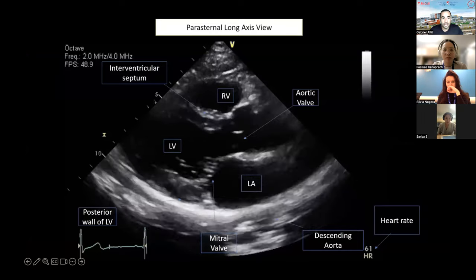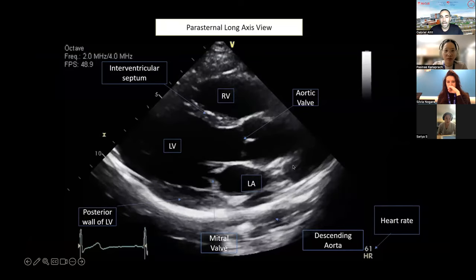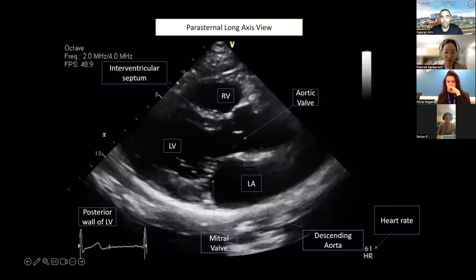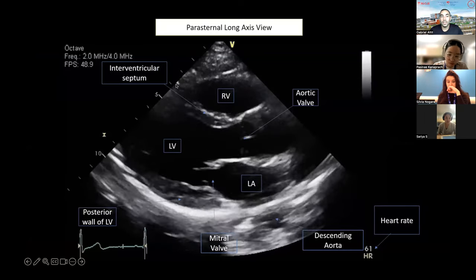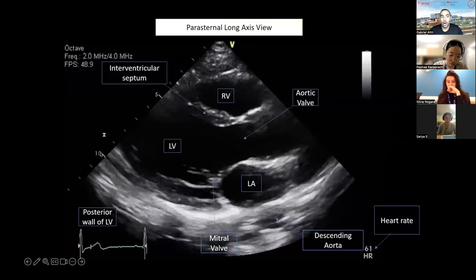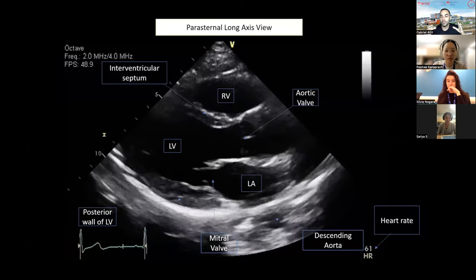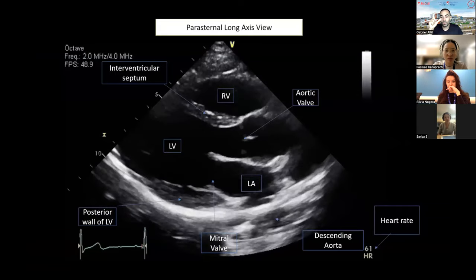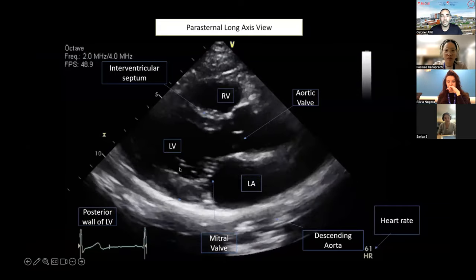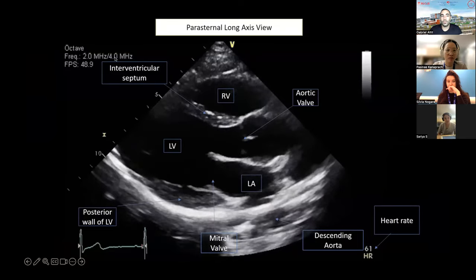And here you can see a scale. So we cheated here. This is an adolescent heart. And you can see that this is 1 centimeter, 2 centimeter, 3 centimeter, 4 centimeter, 5 centimeter. So these markers are already providing you information on the actual size of the heart. Okay. And you'll see that in babies these markers are much bigger, like a premature infant. Often you'll have a heart that's like 2 centimeters.